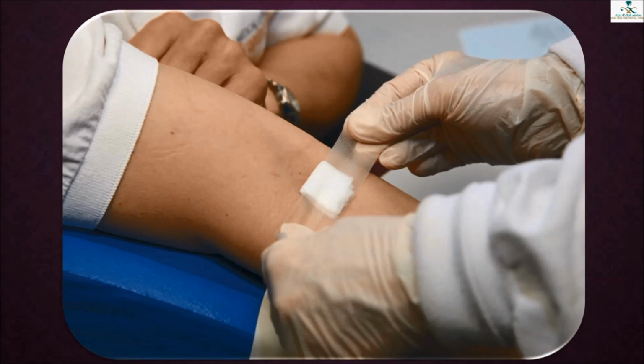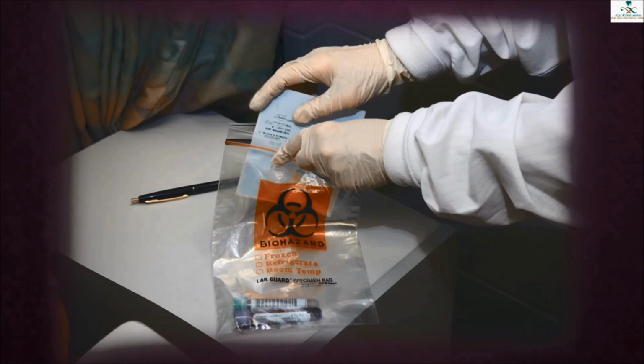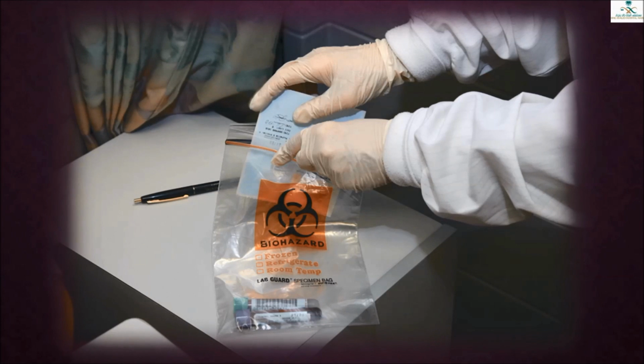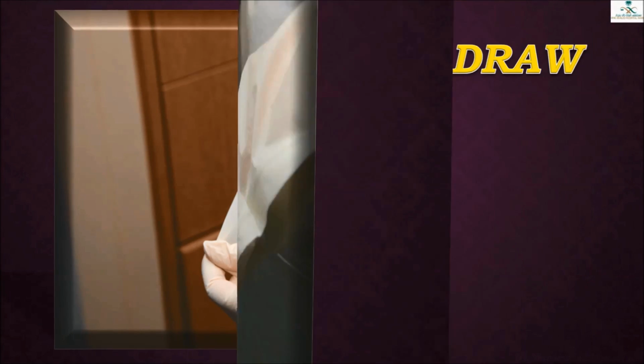Apply gauze in an adhesive tab to the withdrawal site. Label the tube correctly. Prepare for sample transportation in a biohazard bag with the request if needed. Take off the gloves and discard in the yellow container.